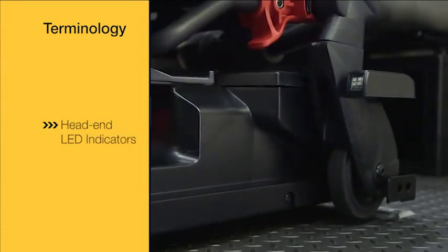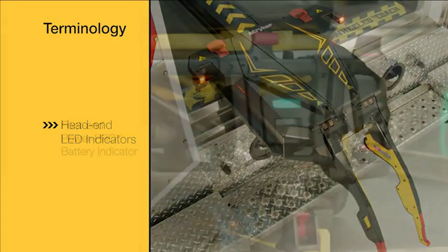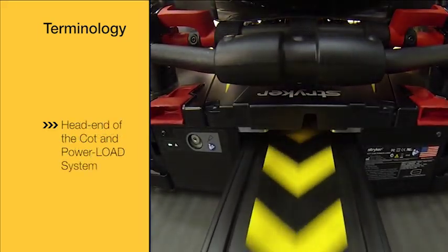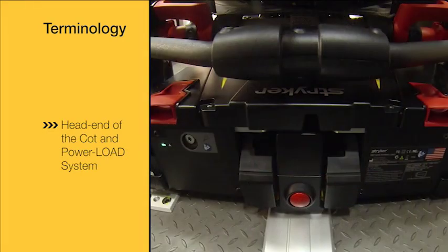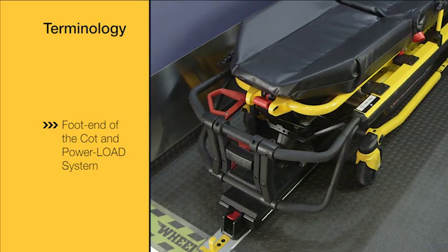This is the component we are referencing when we say head end LED indicators. This is the component we are referencing when we say foot end power pro battery indicator. This is the location we are referencing when we say head end of the cot and power load system. This is the component we are referencing when we say foot end of the cot and power load system.